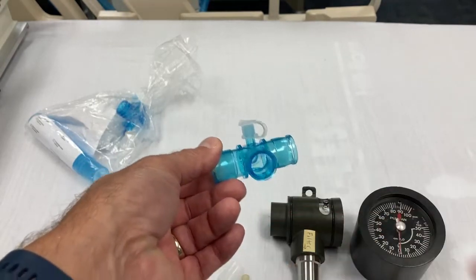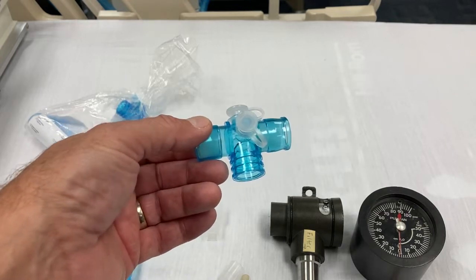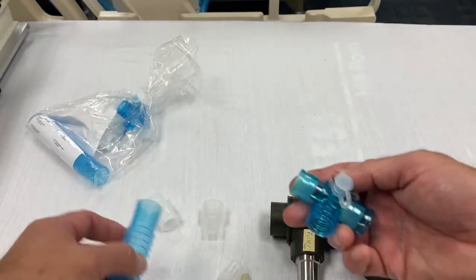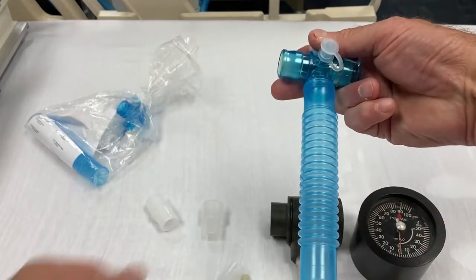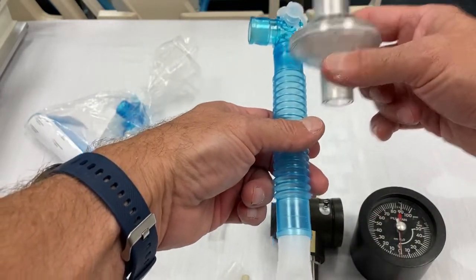This is a 15 millimeter inner diameter, which will fit in a 15 millimeter outer diameter airway. So an ET tube, a trach, whatever you want to hook it to, it'll fit. By the way, if you wanted to do it on a spontaneously breathing person, you just put the corrugated tubing there, and then you can go get a mouthpiece from somewhere and use it that way. Of course, we put a filter in between there too.